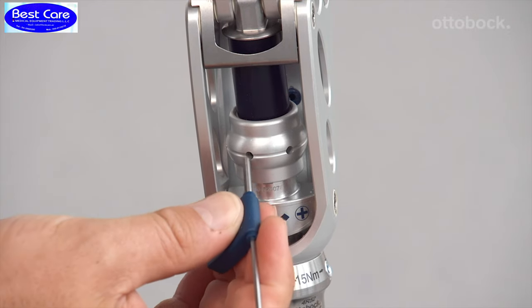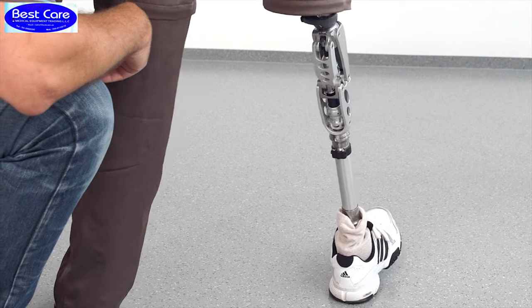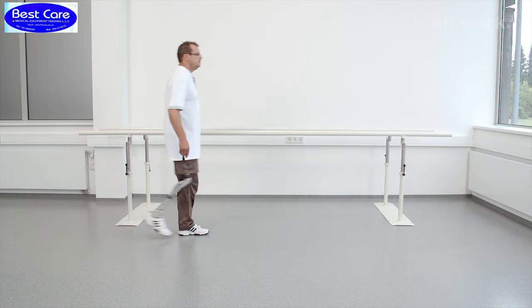Knee flexion is controlled at heel strike by an elastomer element and stance phase flexion is in the range of 0 to 15 degrees. The EBS can be adjusted for different body weights and activity levels via the adjustment ring.